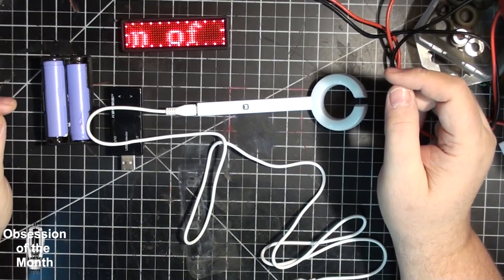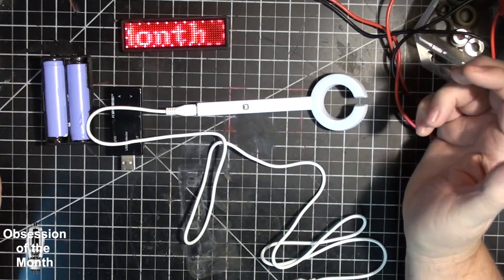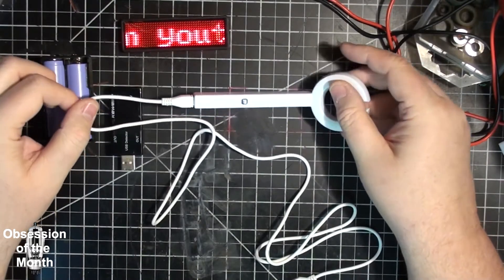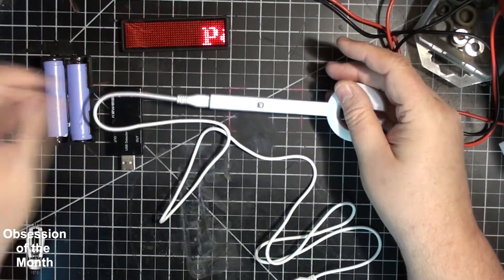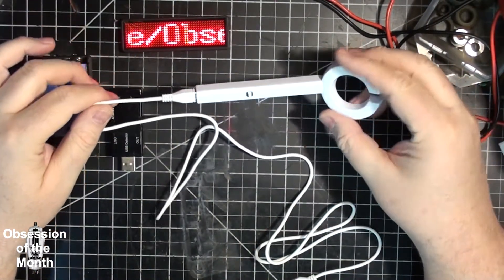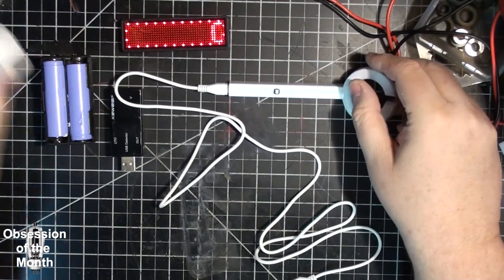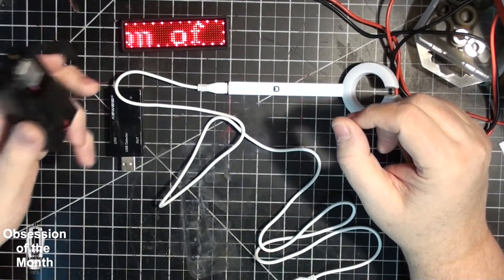To make this portable — because even though these devices are out there, the average phlebotomist does not know they exist — they end up poking, prodding, jabbing, and rooting around in my arm for a vein, when this thing finds it almost immediately. To make it portable, since I didn't have a power bank and didn't really want to buy one, I built one.